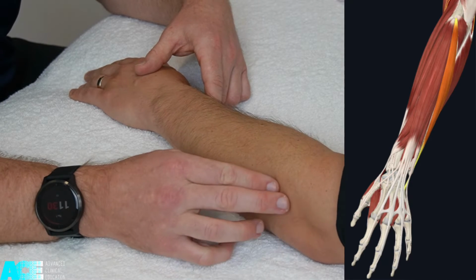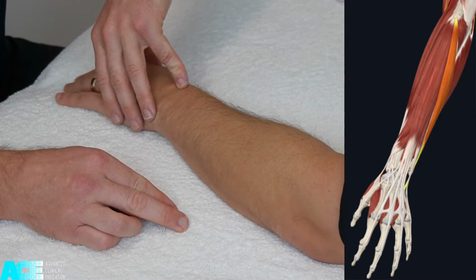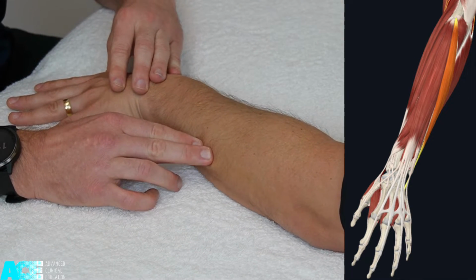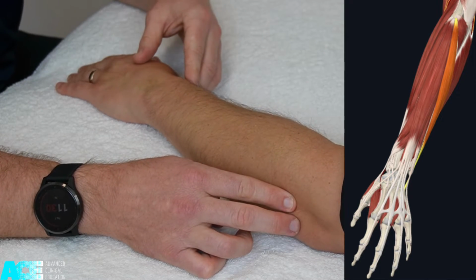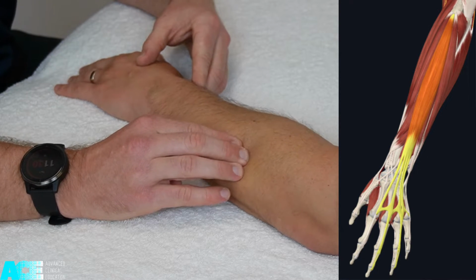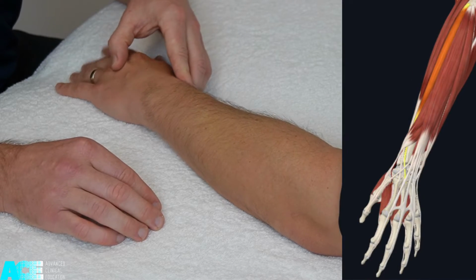Taking a look at the forearm extensor muscle group, starting from the lateral epicondyle, we can ask our patient to move into ulnar deviation and palpate through the belly of the extensor carpi ulnaris muscle. We can then move into the extensor digitorum by asking our patient to wiggle their fingers and palpate through the belly of this muscle down towards the wrist.